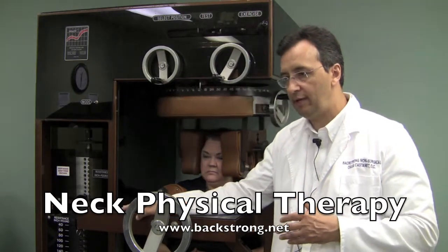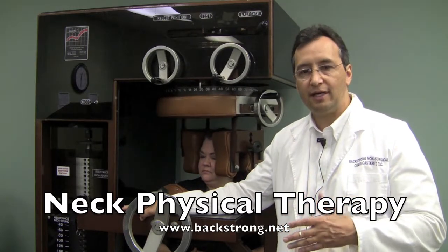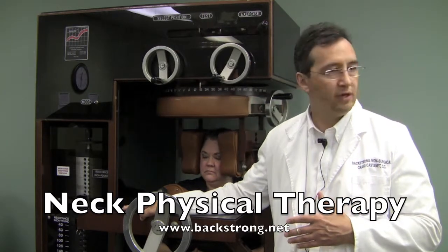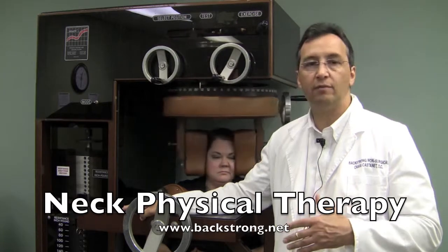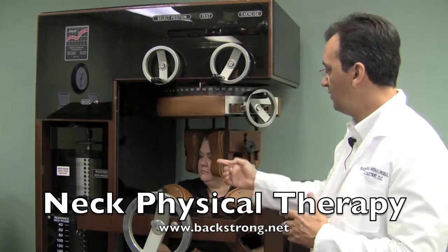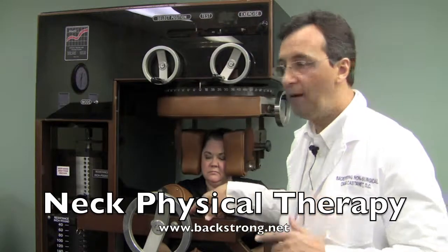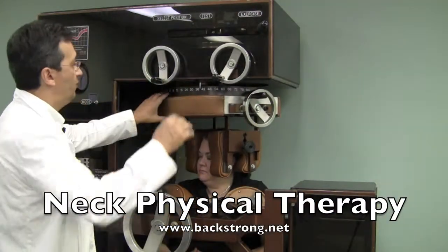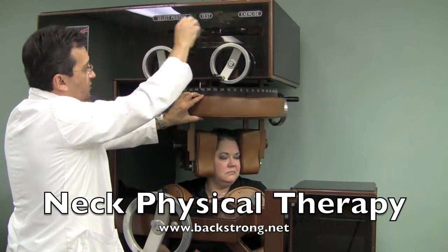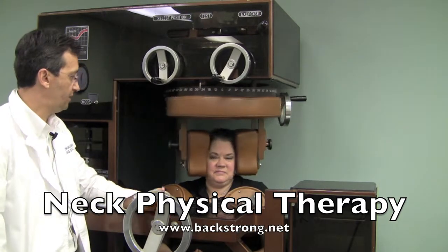Generally people that are treated with this respond favorably from the first treatment. It is in fact what they need, and as a result you're rewarded with improvements in range of motion and less pain generally from the first visit or first treatment session. Right now Marianne is working from the right to the left side. After the person does that, we'll stop. Okay, Marianne, you can stop for the moment, and we'll set the range of motion up the other direction so that now she can lift the resistance coming in this direction, the other way. Go ahead and try that.